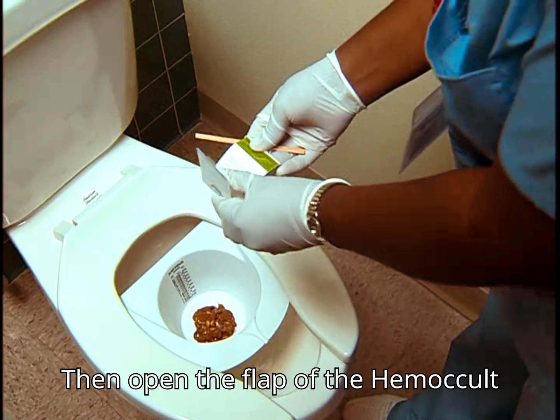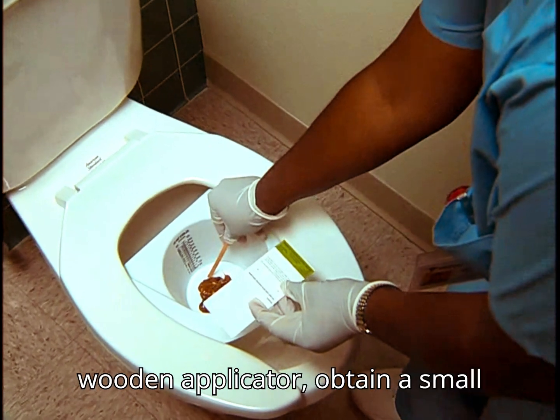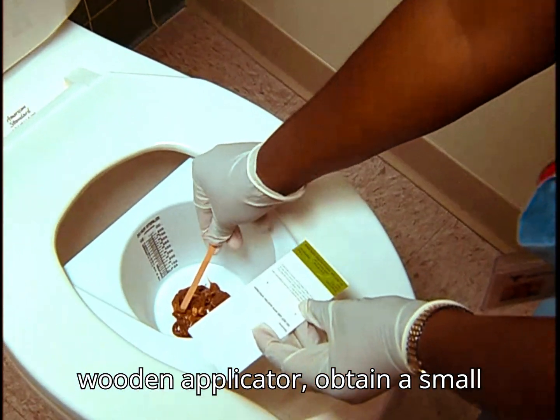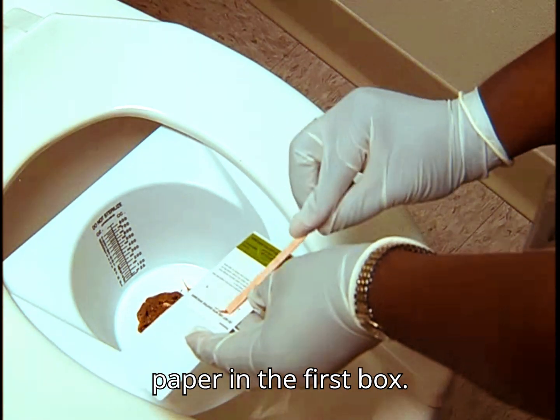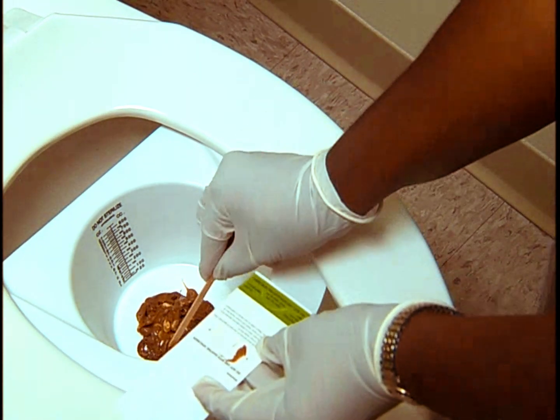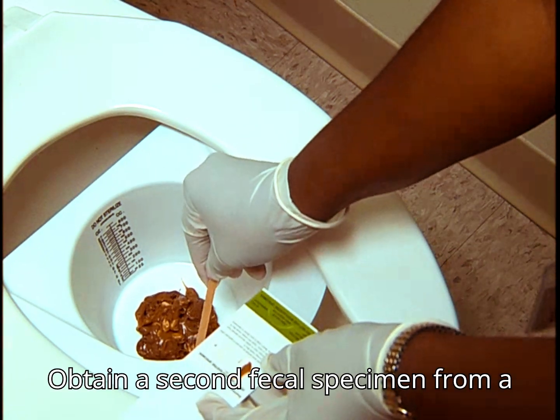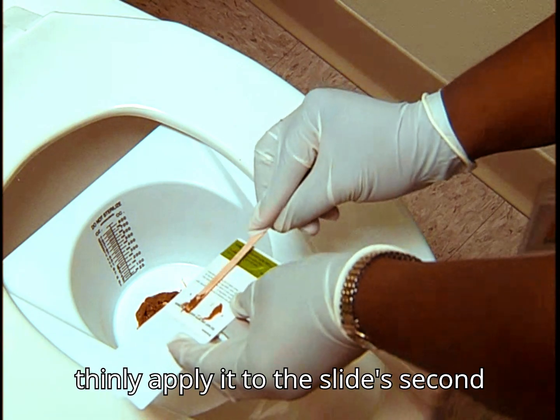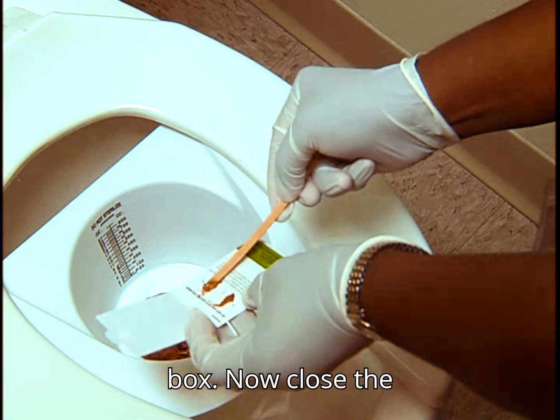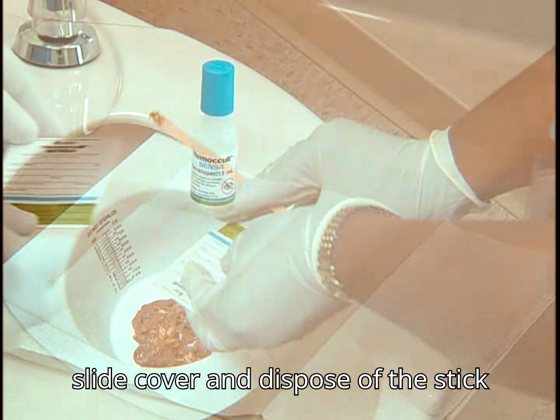Then open the flap of the hemocult slide. Using the tip of a wooden applicator, obtain a small portion of stool and apply to the paper in the first box. Obtain a second fecal specimen from a different part of the stool, then thinly apply it to the slide's second box. Now close the slide cover and dispose of the stick properly.